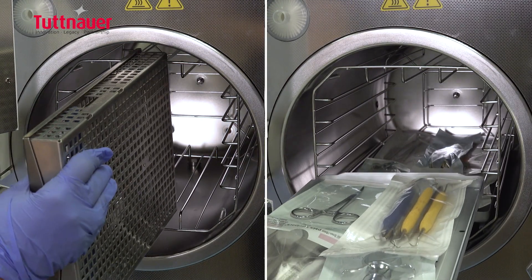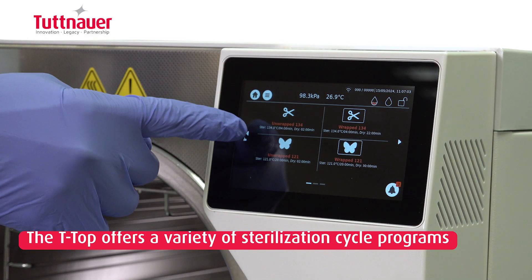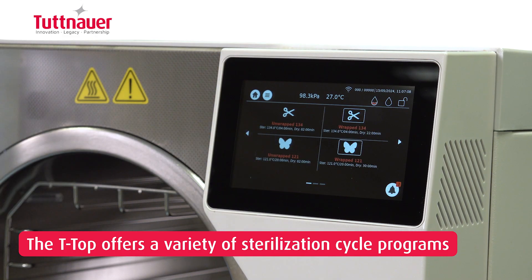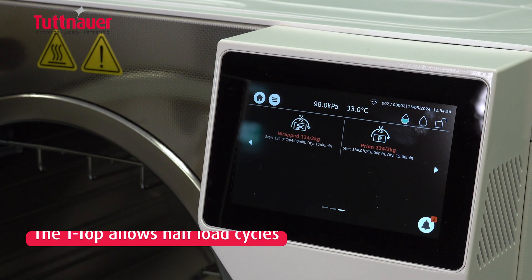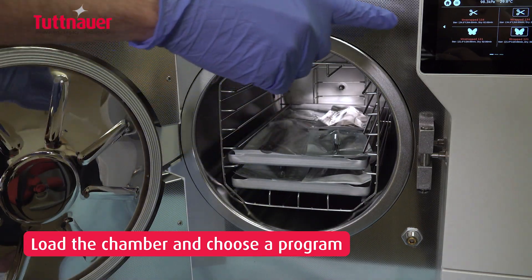The T-Top comes with a unique rack system that supports both trays and cassettes. It offers a variety of simple and intuitive sterilization cycle programs. You don't always have a full load to sterilize — the T-Top has a great feature that allows half-load cycles. Simply load the chamber and select the suitable cycle program.